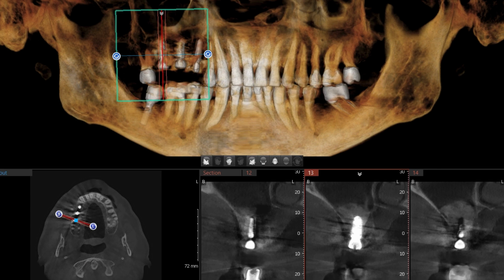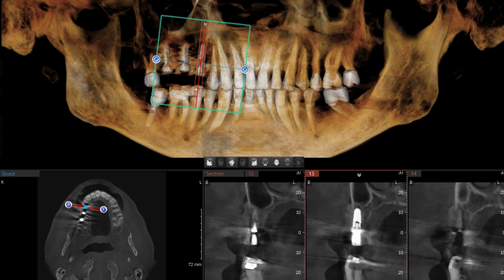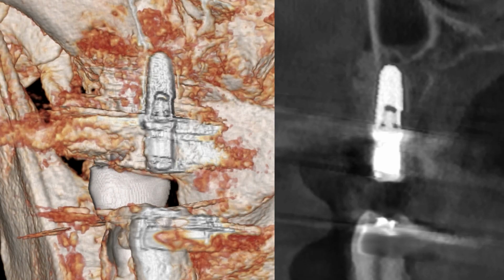And of course, on the posterior, the most distal implant, we see exactly that. What I see is that the bone is packed tightly, so there are no voids, and somewhere there is a cross-section of the replaceable bone window that can be viewed in high-power magnification. So using this feature on the Vatech software, we are able to do slices at different areas from the three-dimensional rendition, and we can see some very nice images that correlate.